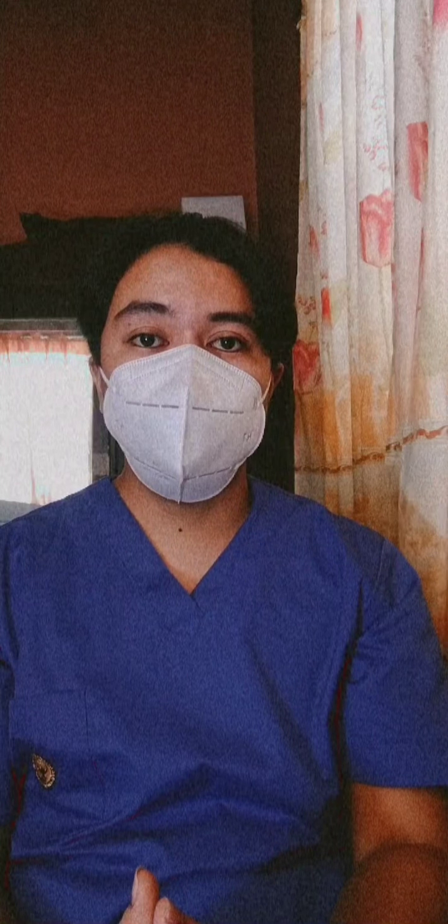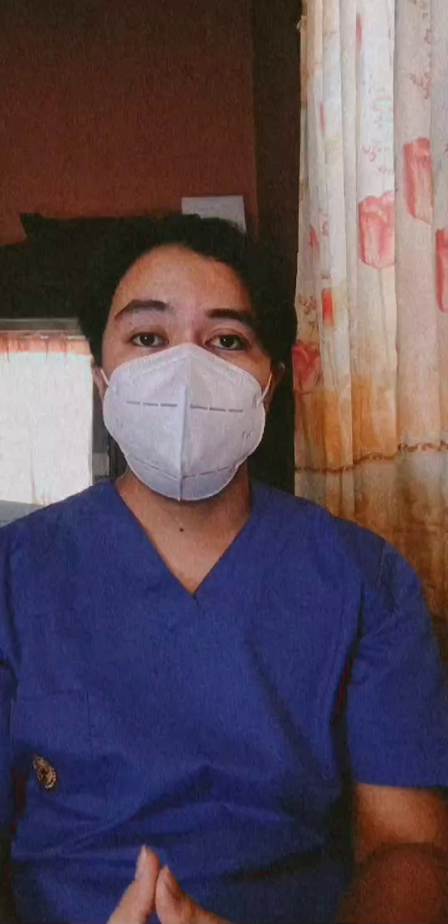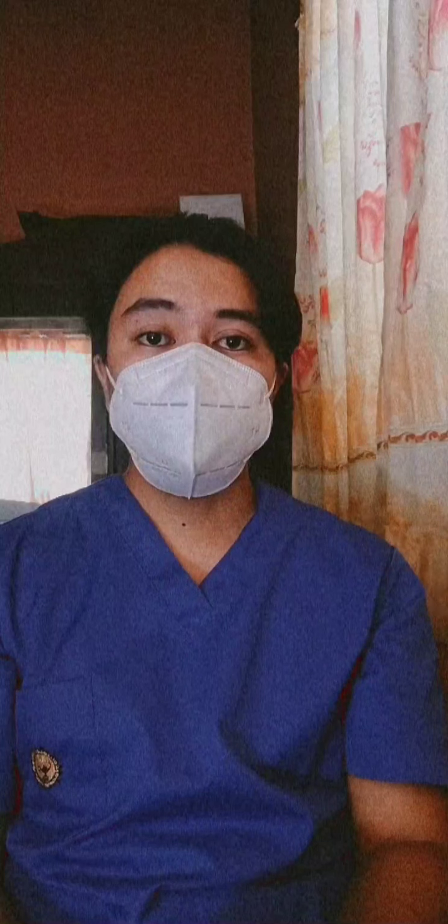For planning, we need to gather all the materials needed for us to work comfortably, and then we need to also provide privacy to the patient by closing the doors and the windows of the room, and then by draping the patient accordingly. Next, we need to position the height of the bed in a comfortable working position, and then stand on the right side of the patient if you are right-handed, and stand on the left side if you are left-handed, and then wash hands, perform hand hygiene, and put on gloves.